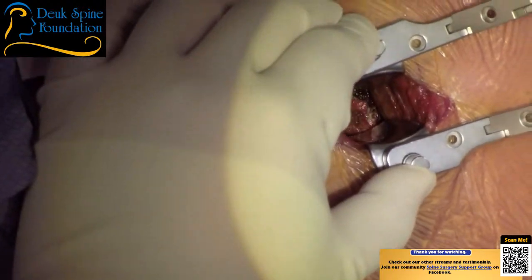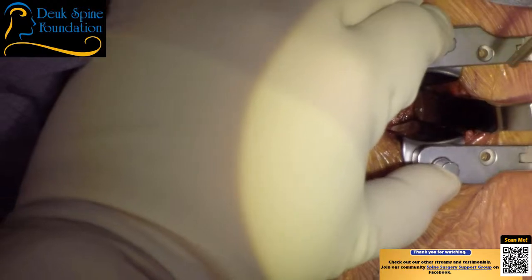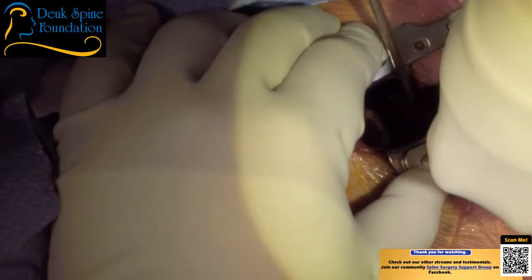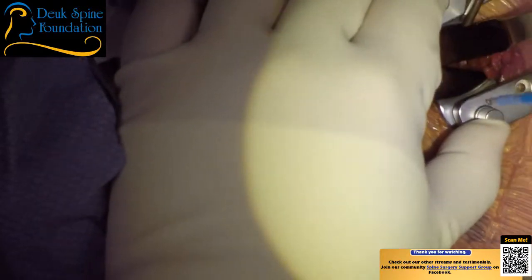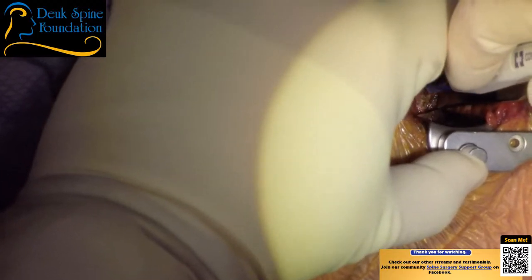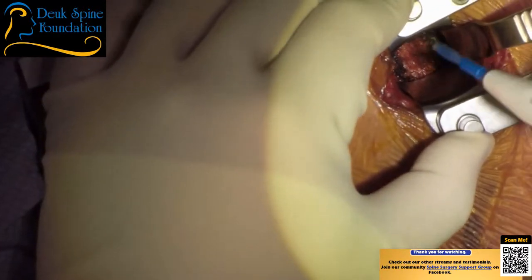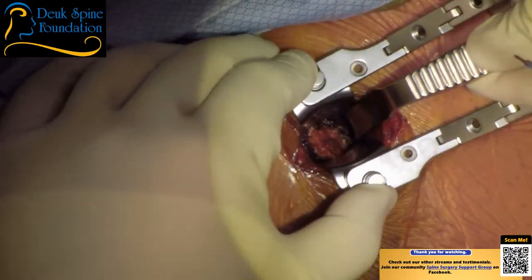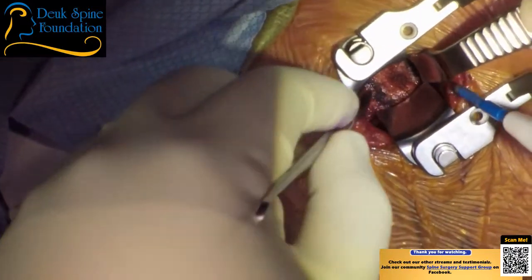Dr. Patel, I need you sucking here. All right, and hold this for me. Hold that, yep. I need a Bovie. Yes, sir. Don't move this retractor. So again, this is C6-7, very, very difficult to do. And up north, let me have a Penfield. Okay, just stay where you are. Don't move the retractor. So far, it's going really good.